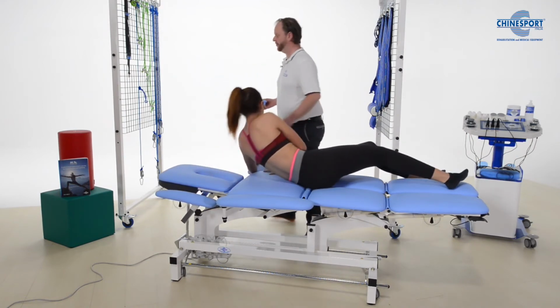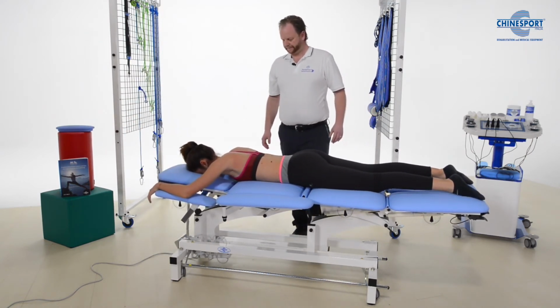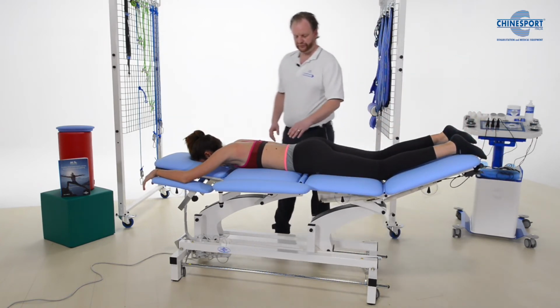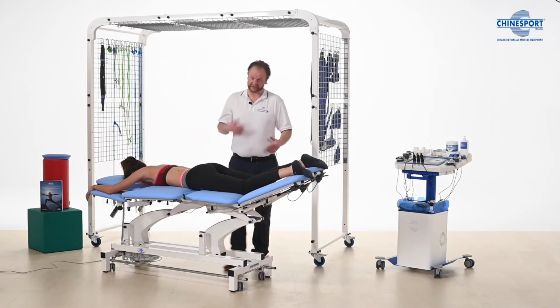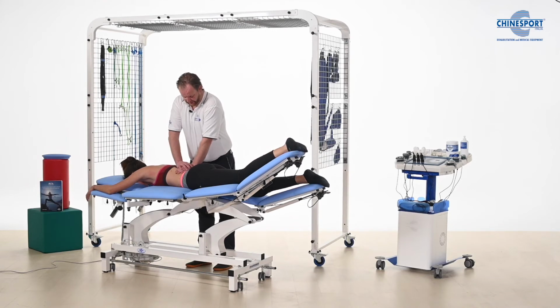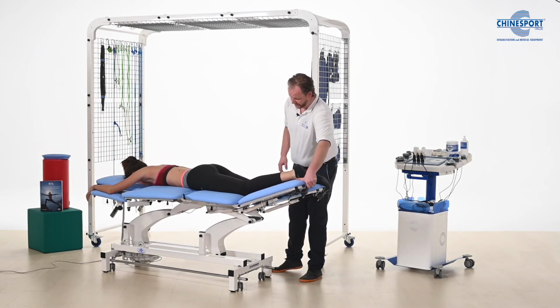And then our patient can lie on her back, or on her front, rather. We can use this here to take some tension off the neural structures. We can do our mobilizations, posterior to anterior mobilizations through the spinous processes or through the transverse processes. If in some cases we want to add some rotation, then we can add that little bit of rotation here by just working with the leg segments. At some point we may want to go into extension.